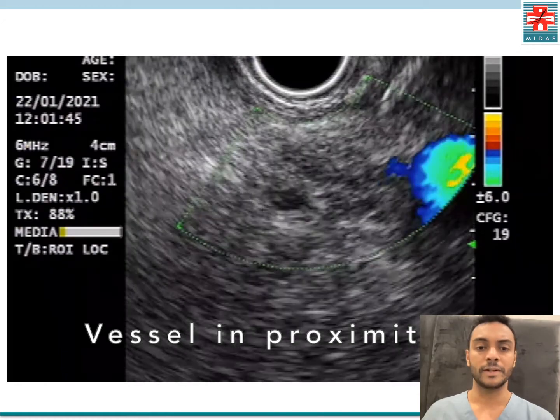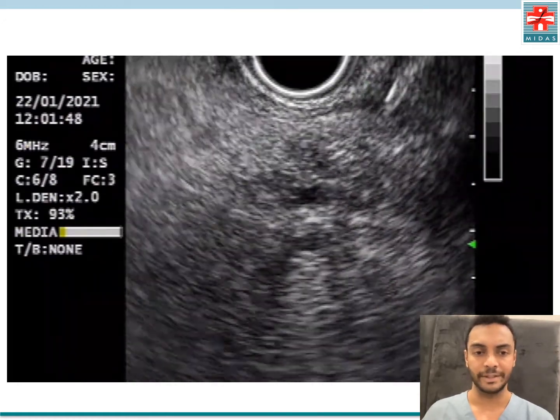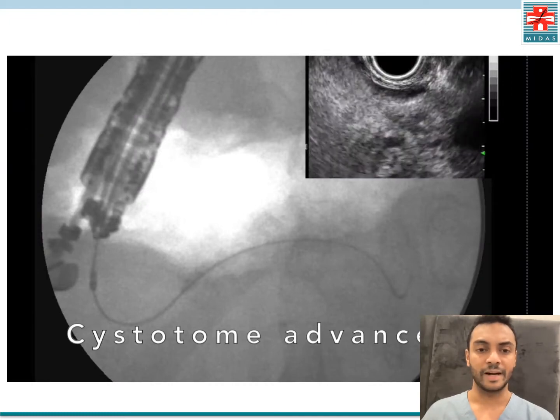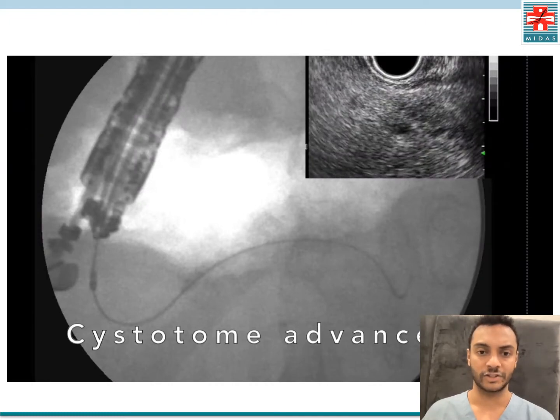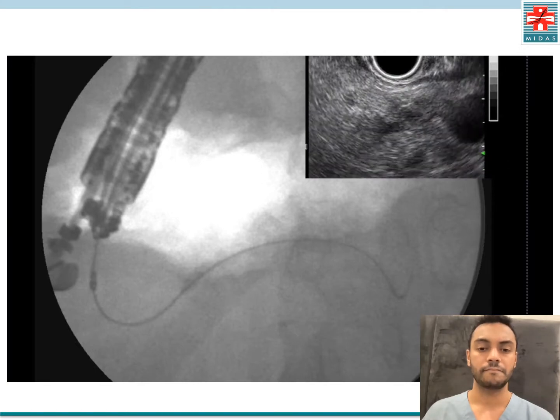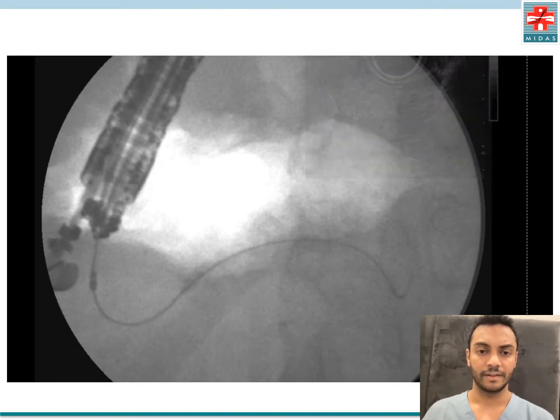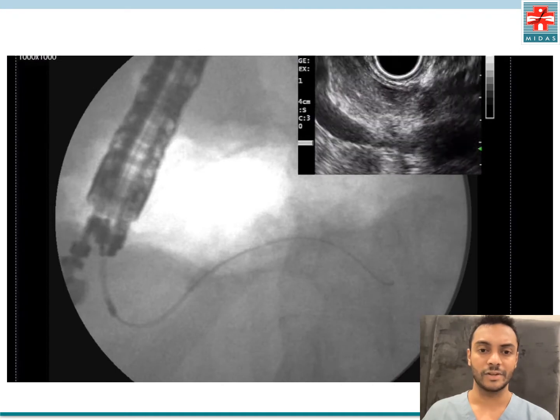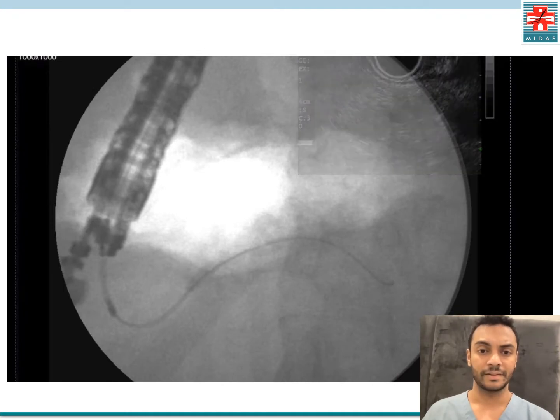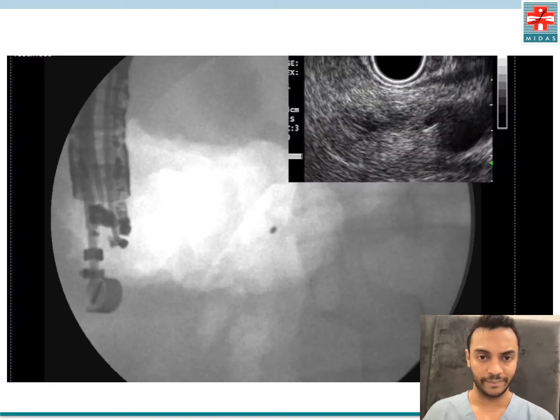We performed Doppler to check for vessels and there was a vessel in proximity, so we had to be extra careful. We then advanced a cystotome across the gastric wall to create the fistula, and then across the pancreatic parenchyma — gradually it was eventually advanced into the pancreatic duct successfully.